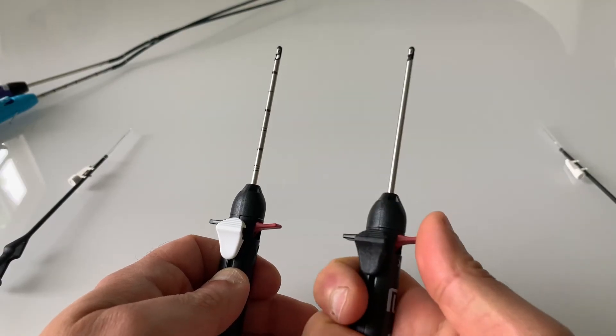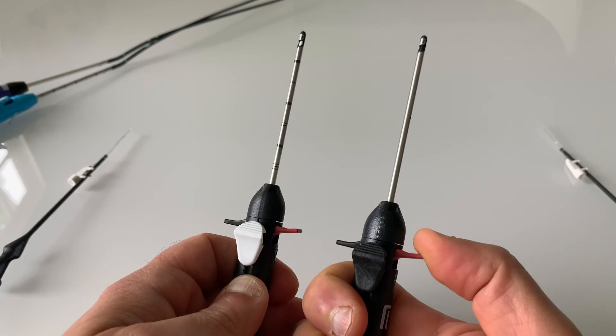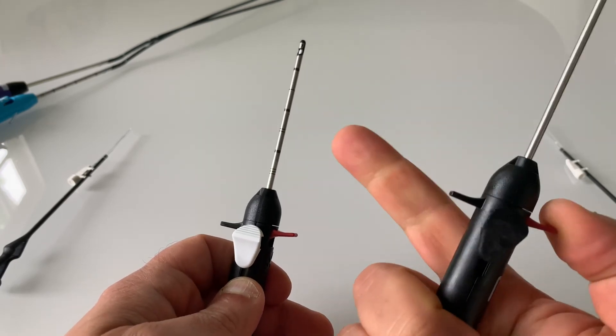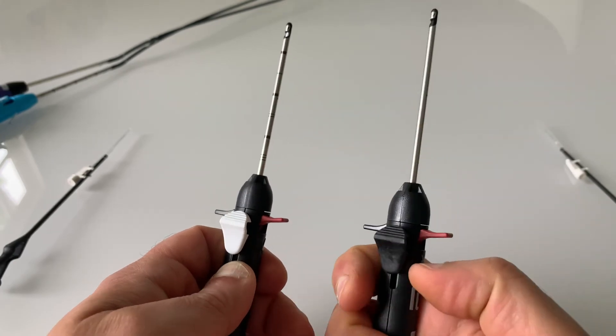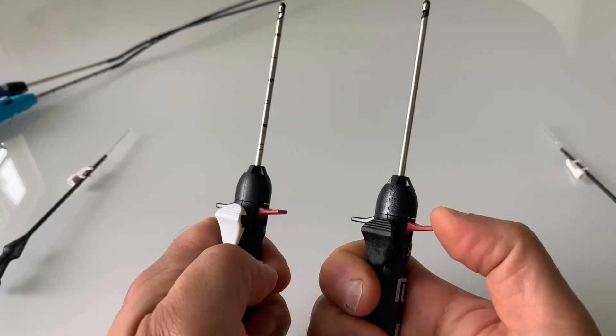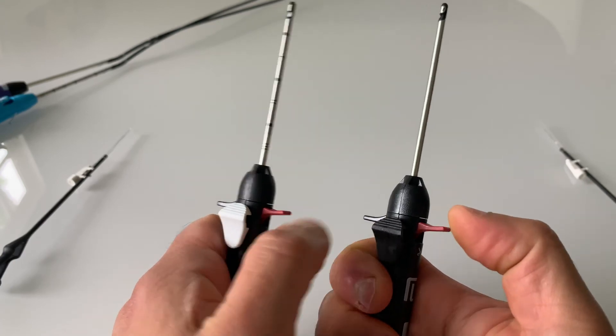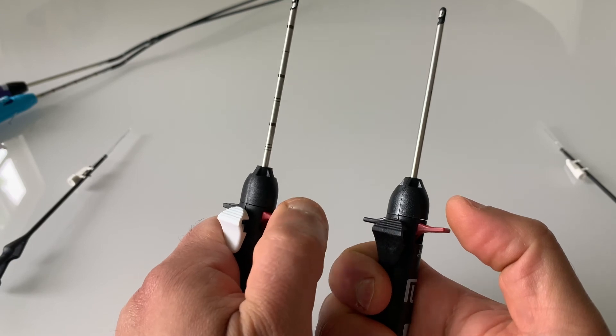For the final step, the final suture cutter has also been modified. You can now see depth markers along its shaft, and the cutting handle has been made much stiffer in the new design compared to the original.